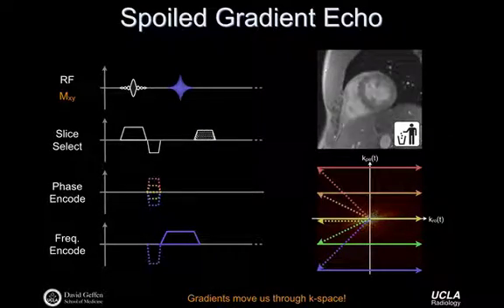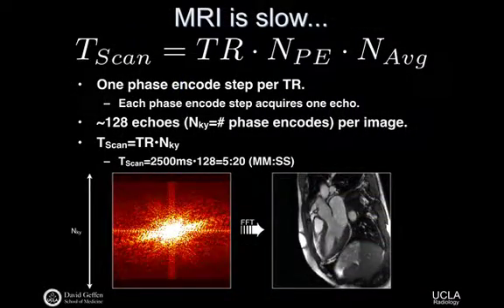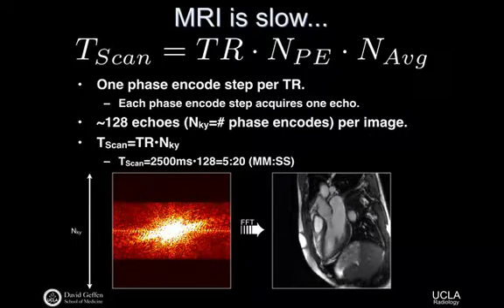Right. And that's just to remind you that we have to spoil our magnetization. There's another pulse sequence, a great one, where I have a little guy that's recycling, because the gradients themselves return back to the middle here. So you can be wasteful and use the gradient echo sequence, or you can use balanced SSFP, recycling.